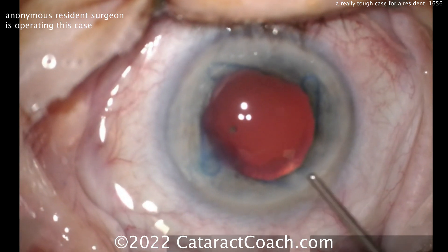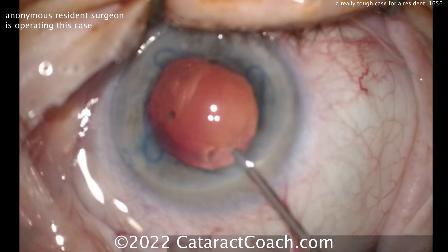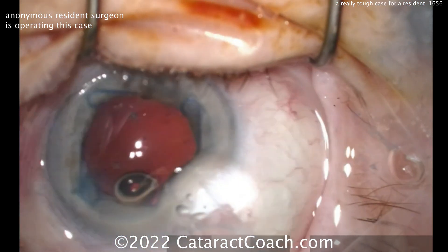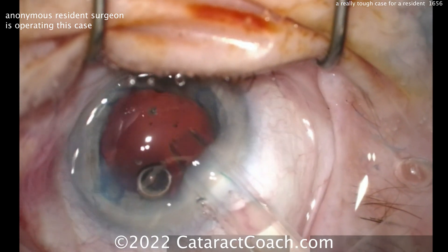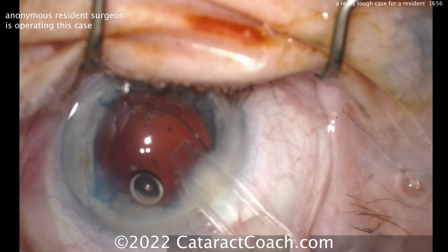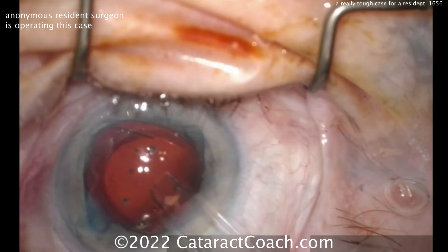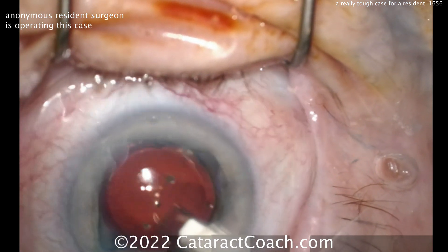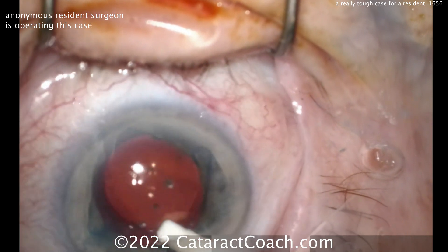Depending on your lens power, you may want to enlarge the incision. If you have a very large lens power — 28 diopters or more — you may need a bigger cartridge. Now putting the lens in — looks like a three-piece lens. The second hand helps here. That injector is a Bausch & Lomb LS61AO soft-port injector — it's a one-handed injector. The right hand is doing it, but the left hand has to do some work. The left hand should be holding a chopper or a Sinskey, helping dial that lens in and getting it in the bag.